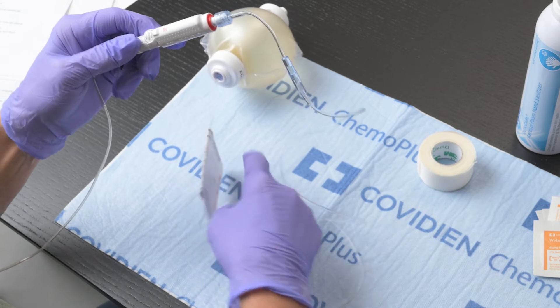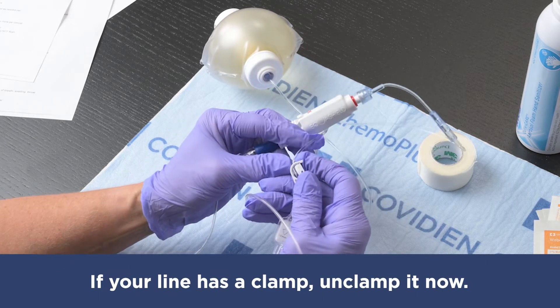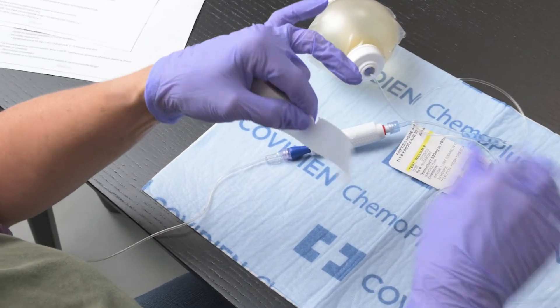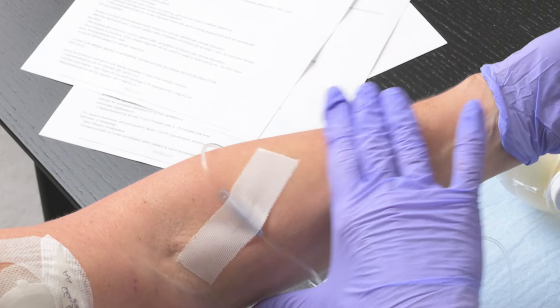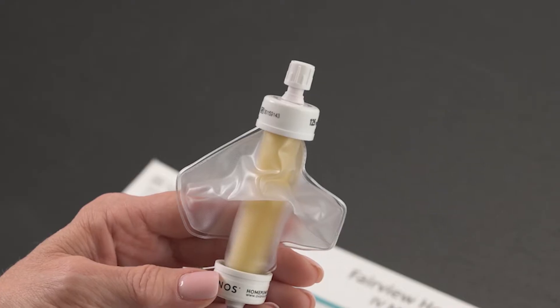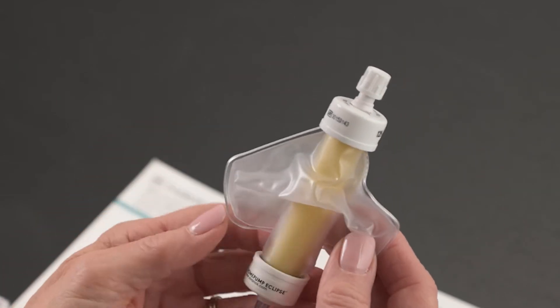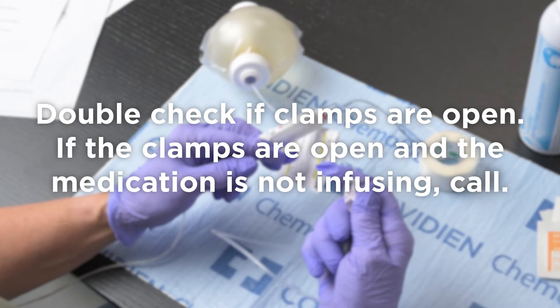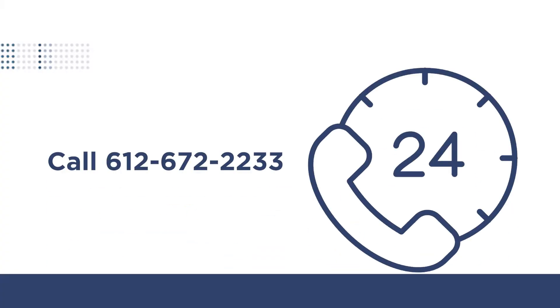You are ready to begin your infusion. For home pump infusions, simply open the clamp to start the infusion. Look for a flow restrictor on the tubing and tape it to the skin with the tape provided. Your medicine ball will infuse medication at the prescribed rate. The total infusion time will be on the label of the medicine ball. Monitor your infusion progress by watching the ball deflate. Your infusion is complete when you can see that the balloon inside the ball has deflated around the cylinder. If the medicine ball does not deflate as expected, double check to make sure all clamps are open. If the clamps are open and the medication is not infusing, call Fairview Home Infusion.